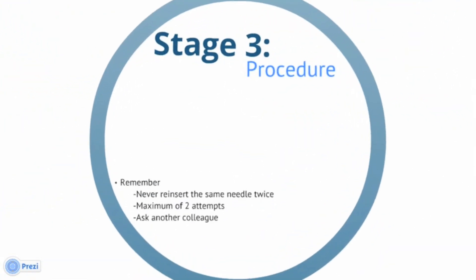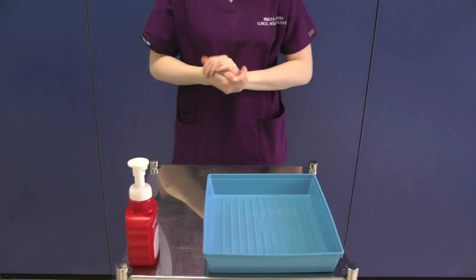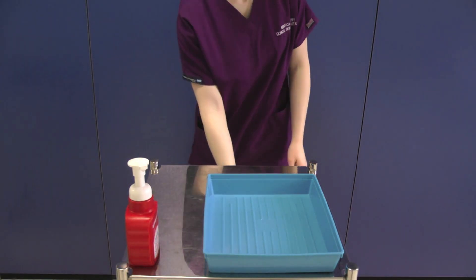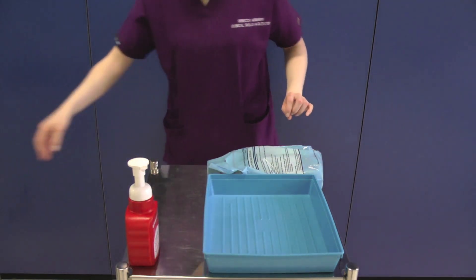Stage 3 is performing the procedure itself. This video will demonstrate how to gather the equipment seen in stage 2 and correctly take blood cultures using the collection set. For the purposes of this video we will start with a clean trolley and tray. Our videos on venipuncture and cannulation demonstrate this cleaning process. Once your trolley and tray are cleaned, decontaminate your hands using the WHO 7 stage hand washing technique — this must be used every time you decontaminate your hands. Gather the equipment onto the trolley making sure there is a sharps bin to hand. Do not put the unopened equipment in the tray at this point.